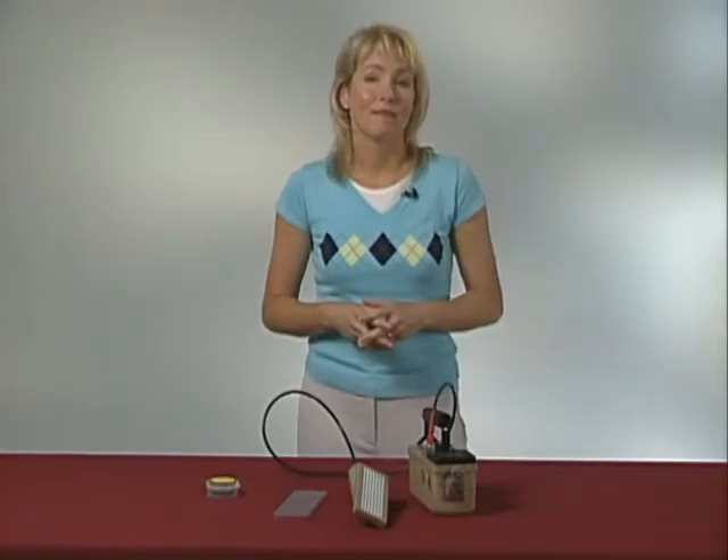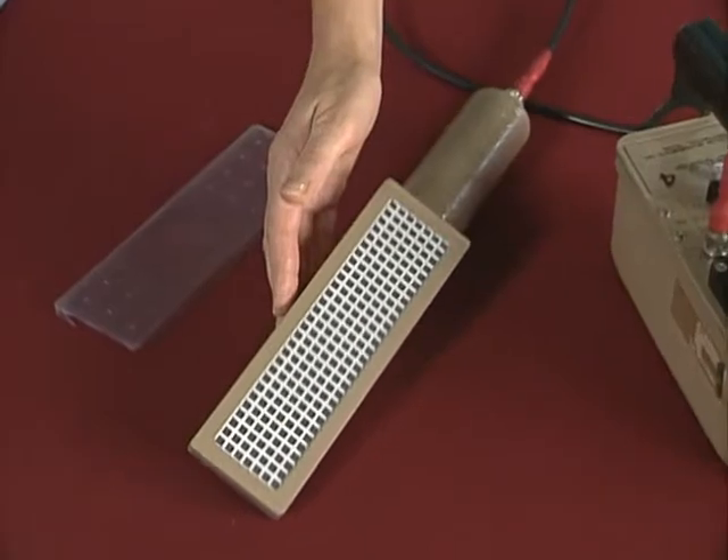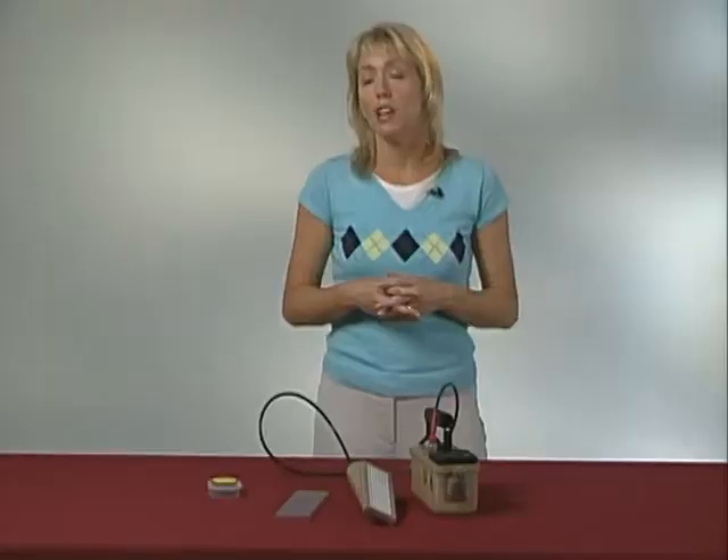Now let's take a little time to consider scintillation detectors, another major type of instrumentation. This is a zinc sulfide alpha scintillator. Alpha scintillation detectors work as follows: an alpha particle deposits energy in the scintillator, which then emits a flash of light, and that flash of light is converted into an electronic pulse by a device known as a photomultiplier tube.